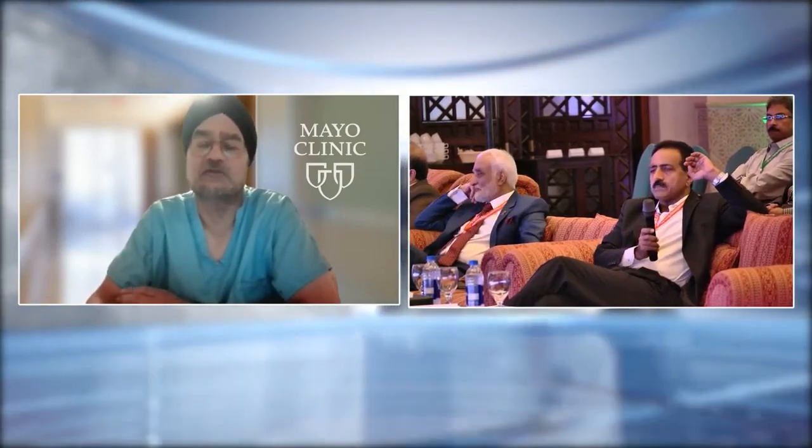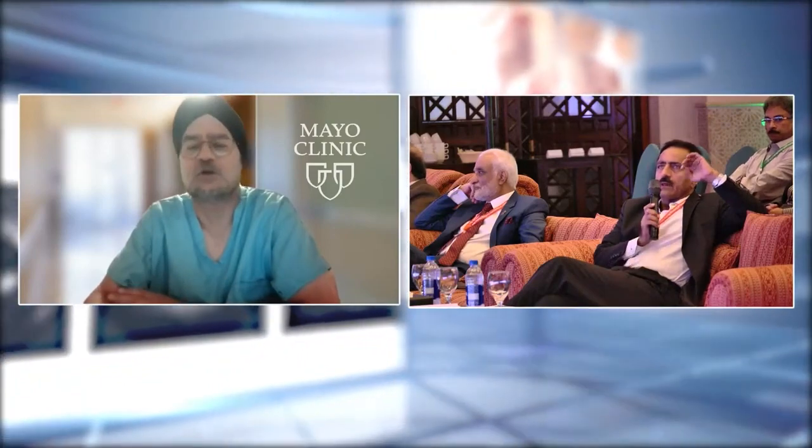Then the second complication that I mentioned is acute coronary occlusion. That can be anticipated, and we can take measures to protect the left coronary if necessary. So I hope I answered your questions.